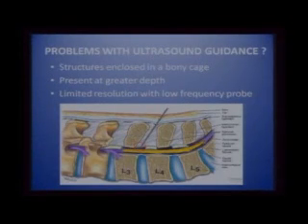So are there problems with ultrasound guidance for the spine? Yes, there are. But before we go to those, I'll just recount for the sake of juniors in this audience. You have the skin, subcutaneous tissue, supraspinous ligament. Then you have the spinous processes. In between is the interspinous ligament. Then you have the ligamentum flavum and the dura, the thecal sac. What is more important and what you see with ultrasound is the posterior dura. Then you also have the anterior dura, the posterior longitudinal ligament, and the margin of the vertebral body. That forms what you call the anterior complex when you see it on ultrasound.